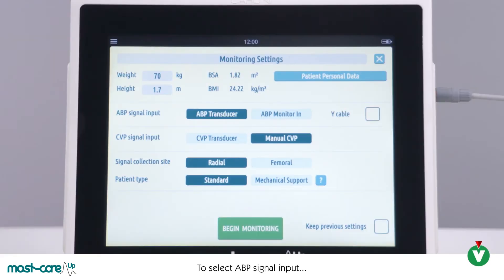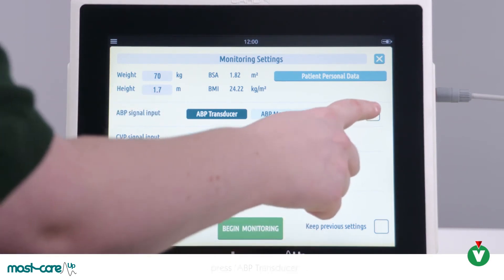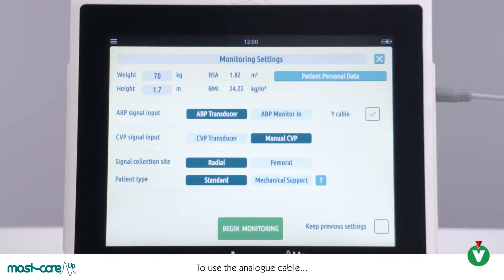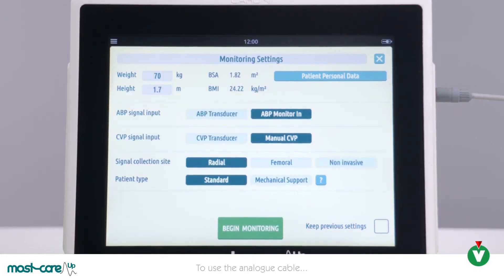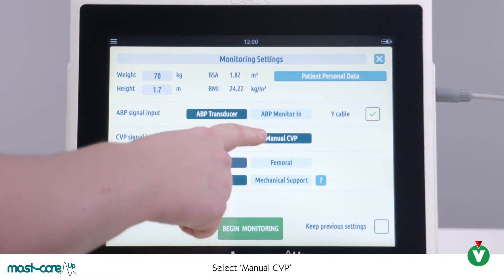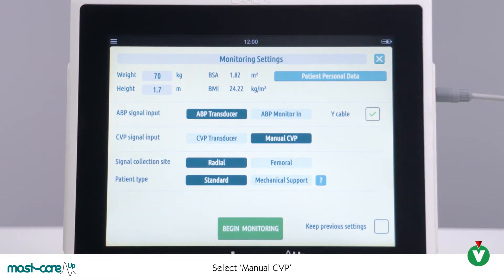To select ABP signal input, choose ABP transducer for an arterial transducer and then select the Y cable tick box. For analog signal, please select ABP monitor in. For CVP signal input, select manual CVP or transducer if you are transducing CVP into the MostCare.